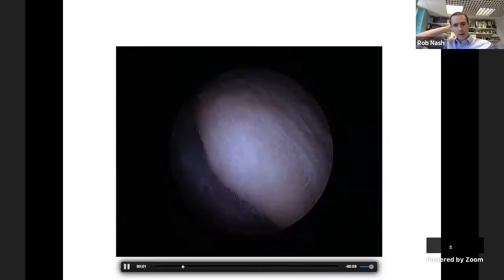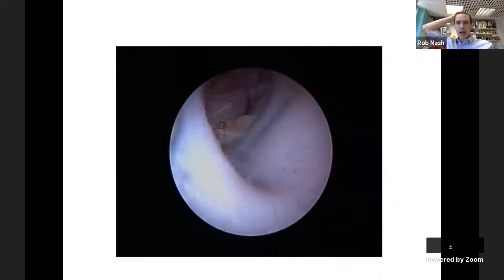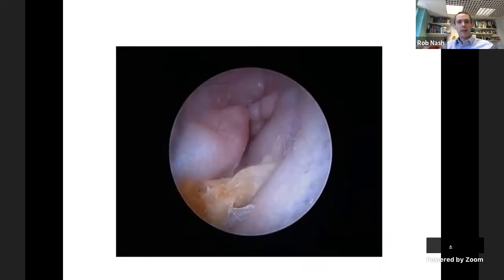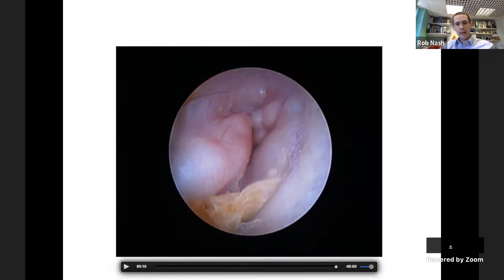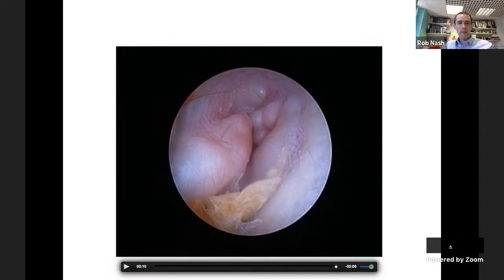This is not inflammatory stenosis but the proverbial surfer's ear - exostoses of the ear canal. They drastically reduce access to the tympanic membrane. We don't know whether there's tympanic membrane pathology from otoscopy alone. Patients like this often have normal hearing, and if hearing is normal we can be relatively confident the tympanic membrane and middle ear are unaffected. If they have conductive hearing loss, we'll likely need imaging to determine what's happening medial to the exostoses.